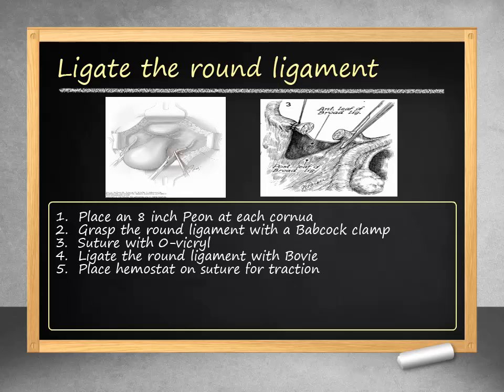We can now begin the hysterectomy portion of the case. First, we identify the round ligament. An 8-inch peon clamp is placed at the cornua to aid in uterine retraction, and another clamp is placed on the contralateral side. The round ligament is then grasped and elevated with a Babcock clamp. Vicryl suture is then placed around the round ligament laterally. While grasping the proximal portion of the round ligament, it is incised with bovie electrosurgery. A hemostat is placed on the suture of the round ligament to be used for retraction later.